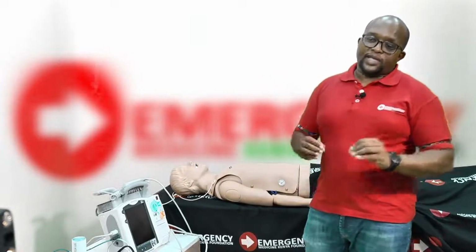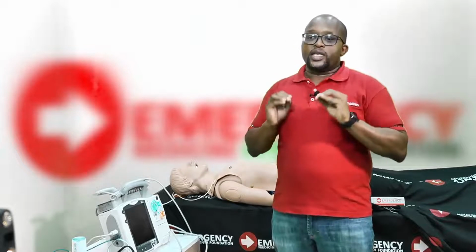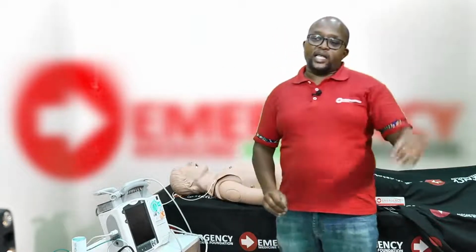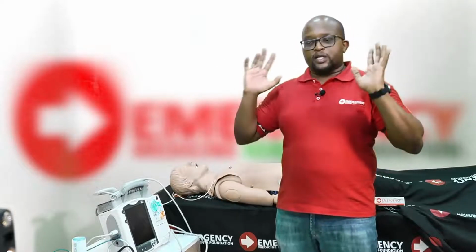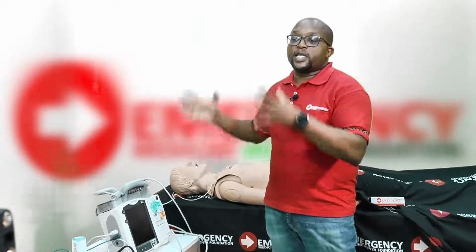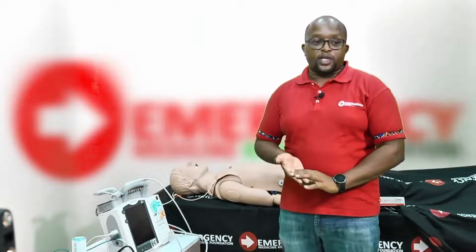But I want to emphasize that any defibrillator you have available is good enough to be used. There is no evidence that one machine is better than the other, or that monophasic is better than biphasic. A defibrillator is a defibrillator. If you have one, find out how to use it and use it on your patient, and it will work as well as any other defibrillator available on the market.